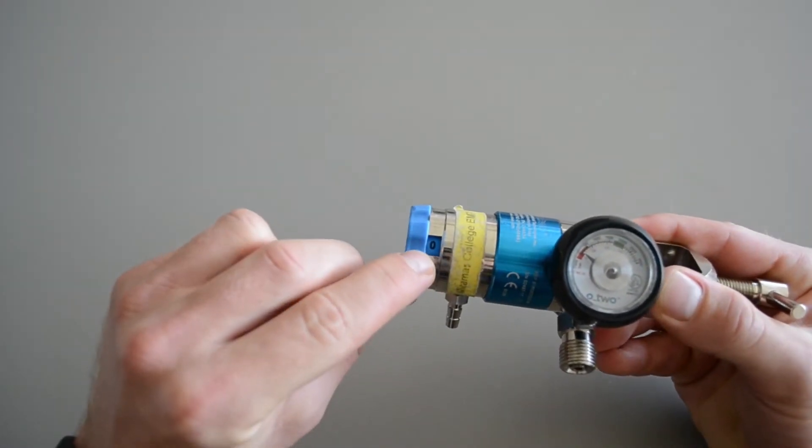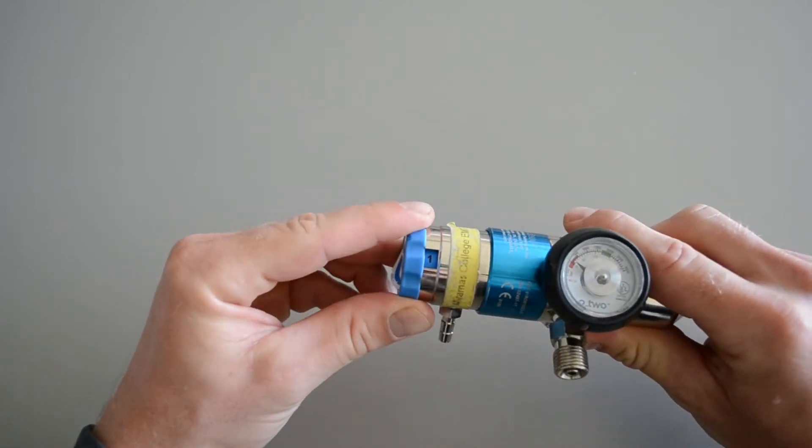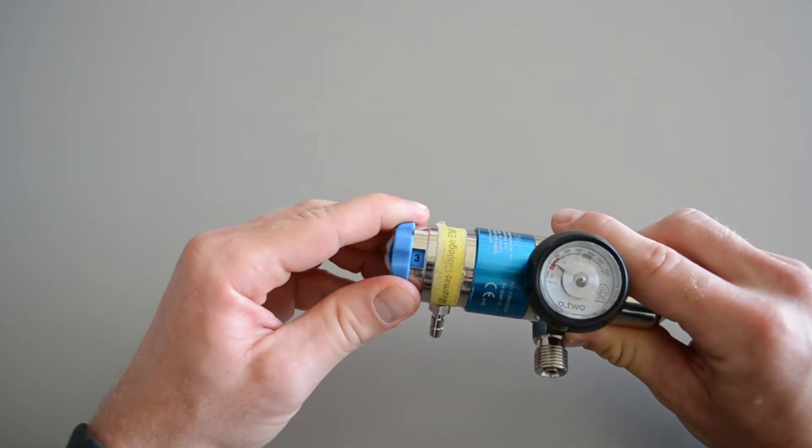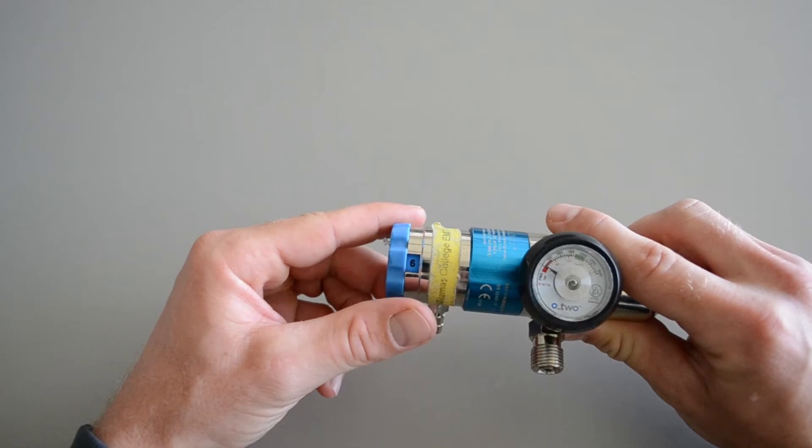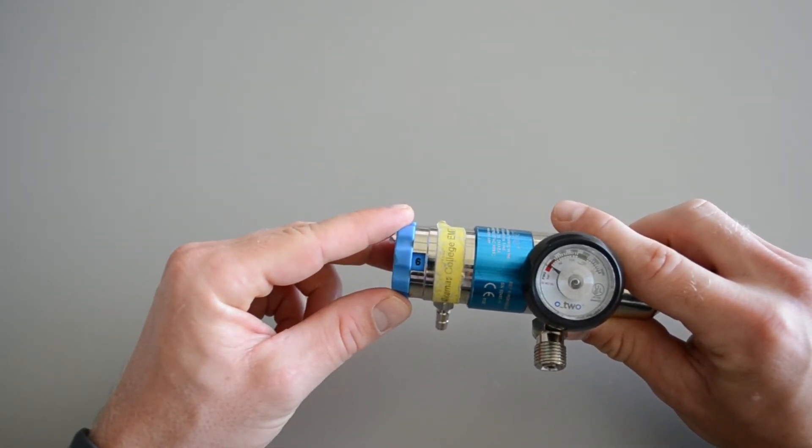This is your flow rate dial. This allows you to turn to the specified liter per minute flow that you would like. So it starts here at 1, goes to 2, then 3, 4, jumps up to 6. So that will be your flow rate for a nasal cannula, anywhere from 1 to 6 liters a minute.